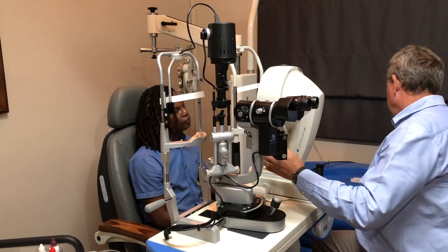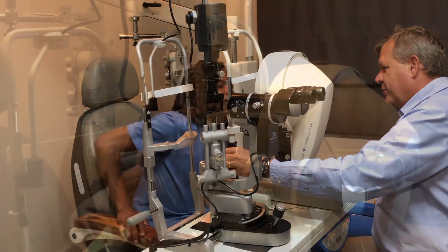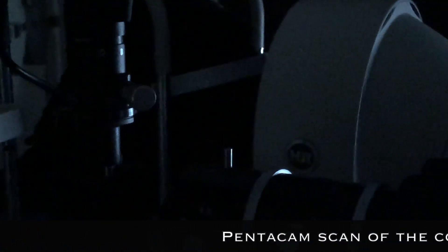As we go along, what we're going to do is explain to you exactly what's going on with your eye. Put your chin down here — this machine doesn't like to bite. Let's start examining.